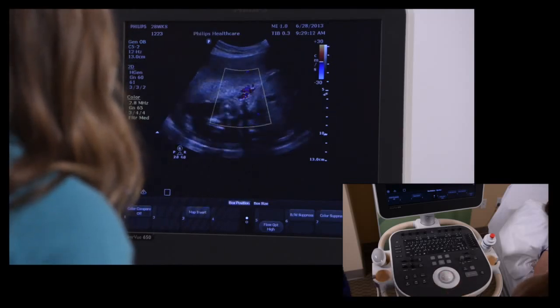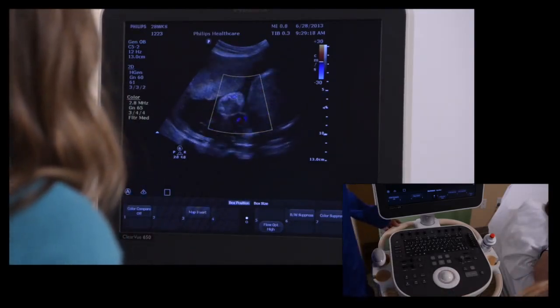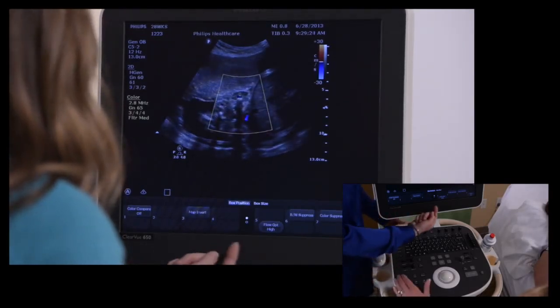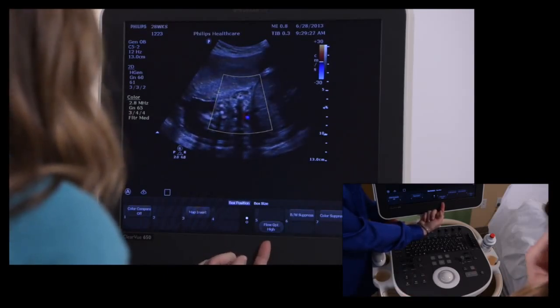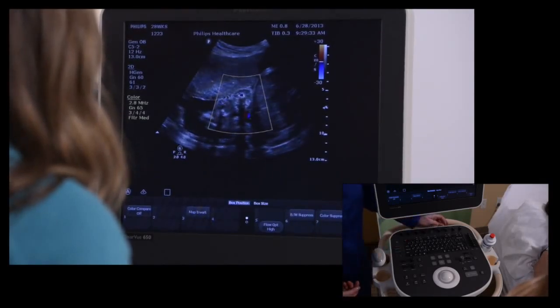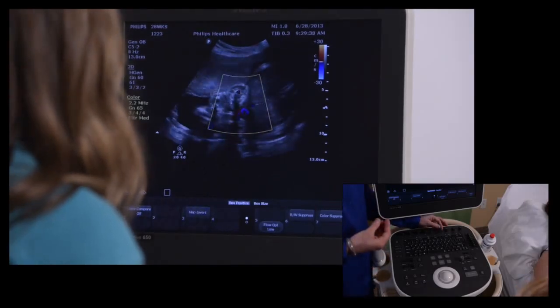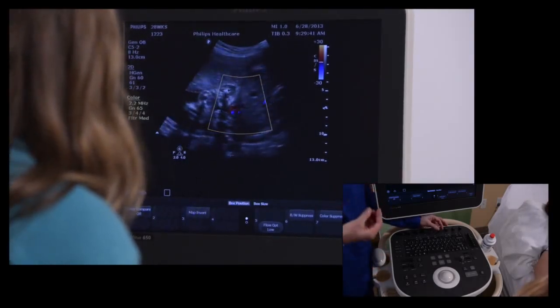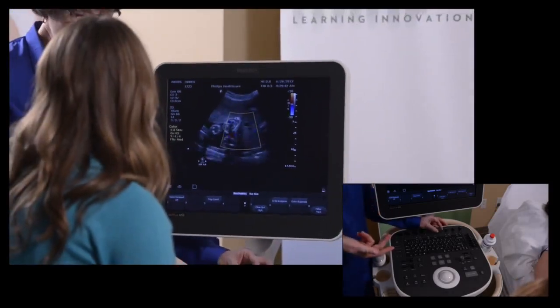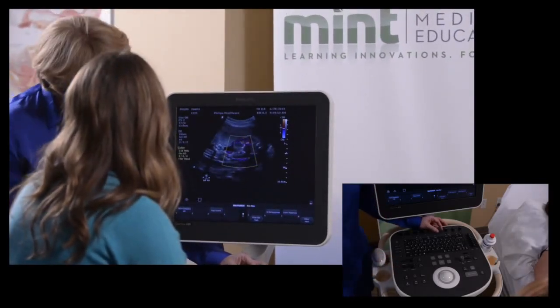If I think the color is too sensitive or not sensitive enough and I want to change my PRF, you can change your PRF directly by your scale. We also have a quick key that will help you with flow optimization — it changes your scale, your baseline, and some other factors. Turning this number 5 button allows you to change your flow state. Lower flow state, for instance, if you were looking for renal kidney flow; higher flow state would be like the fetal heart — something with a faster flow state. This is like a macro key to help you with that.